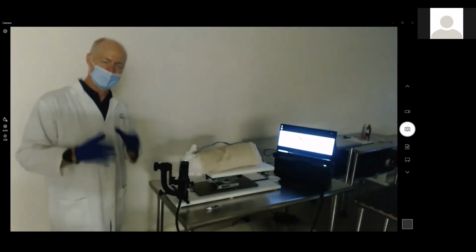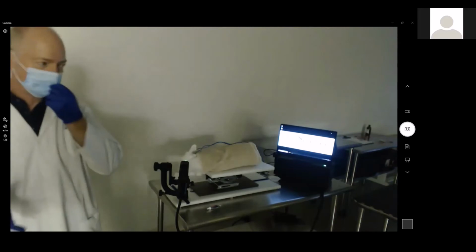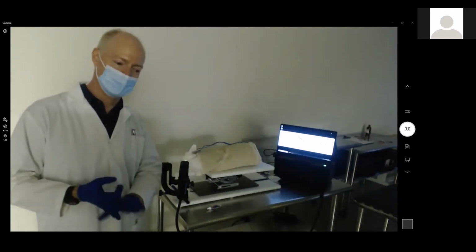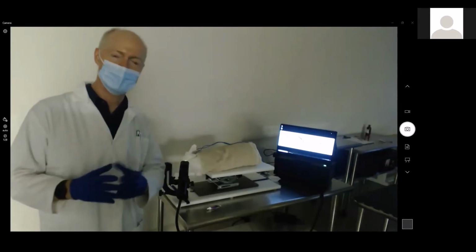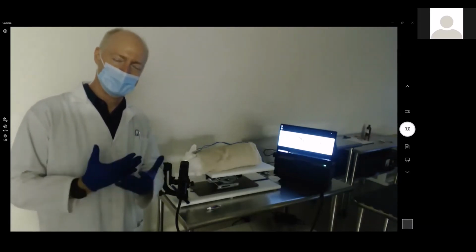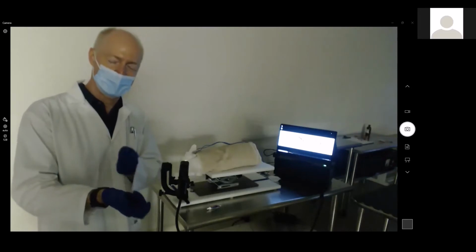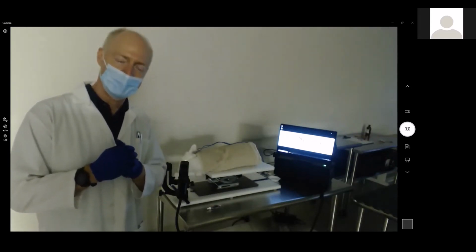The benefit of doing the awake OCT is you get gross anatomical representation. For example, it works really well in cornea. When you've got something that shows clearly there is an opacity or any type of aberration on the cornea, when you use the OCT on the anterior, it really illuminates. It has very clear detail. And it's actually pretty simple to capture because you're just looking at the cornea and you're putting the OCT on the cornea, you can capture those images very, very quickly.